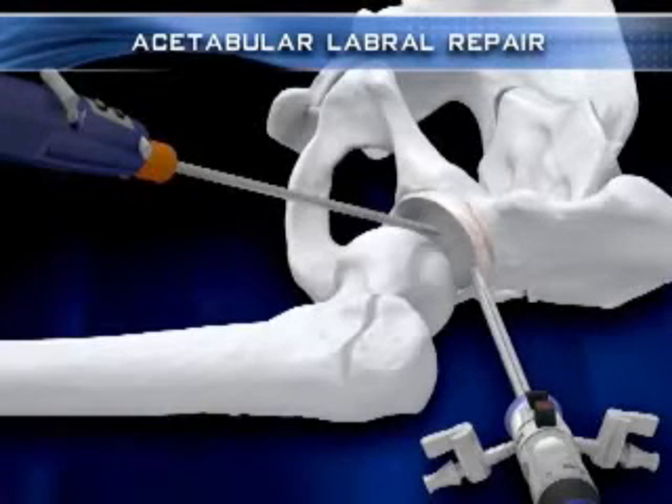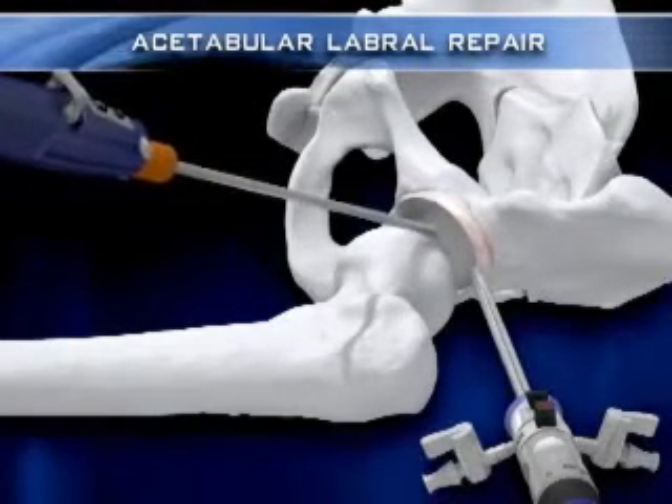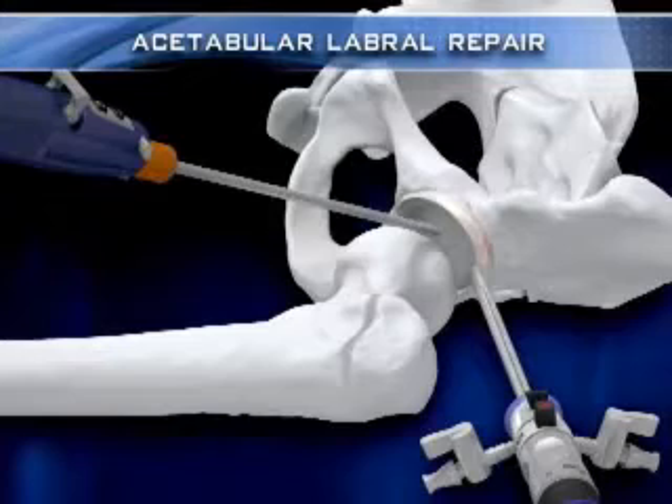Once in the joint and reassembled with its inner sheath and shaver handle, it is used to create a large capsulotomy, making room for instruments to move freely around the hip joint.